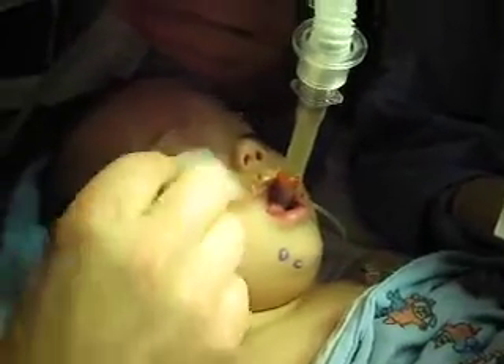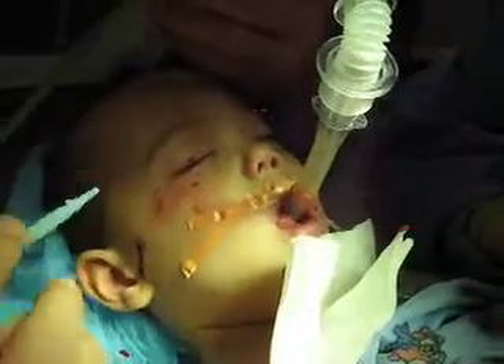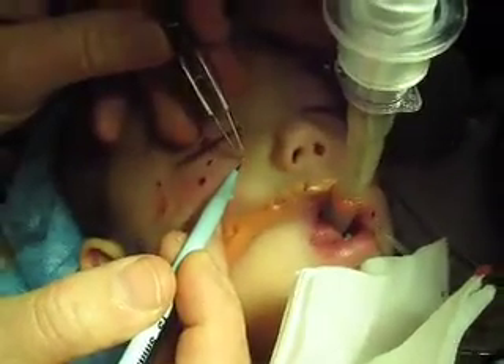So here's some molluscum. This is one of the most difficult pediatric eye procedures. This is a molluscum — it's an umbilicated lesion.